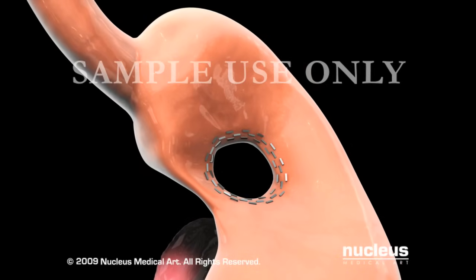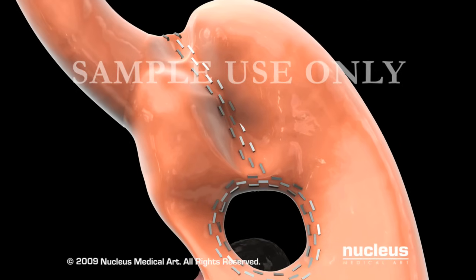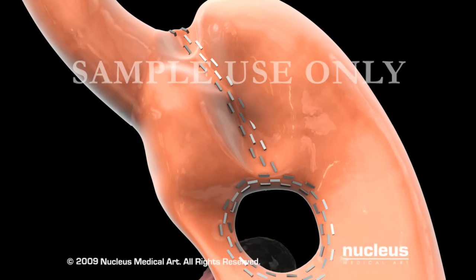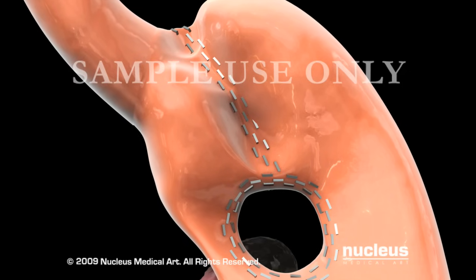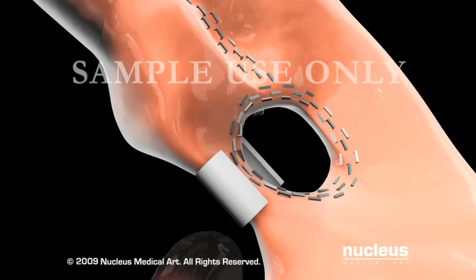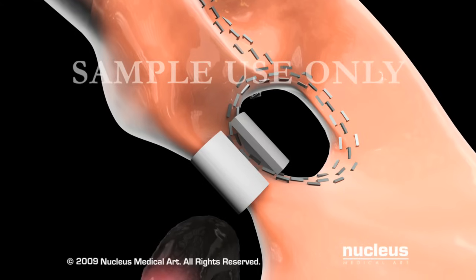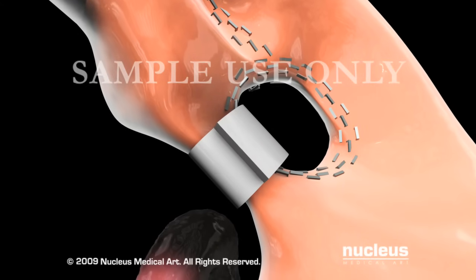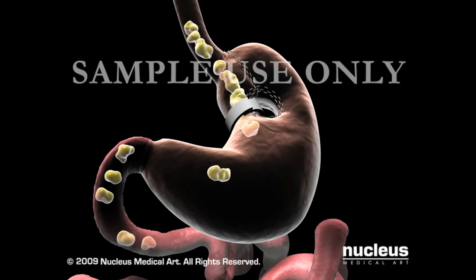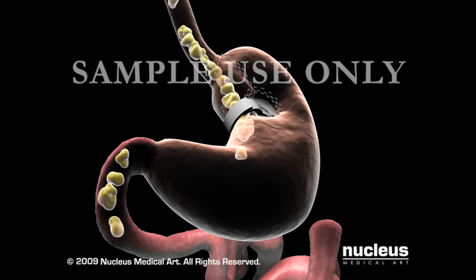your surgeon will cut a window in the upper part of your stomach. He or she will place staples in your stomach around the window and toward the esophagus to create a small pouch on top. Next, your surgeon will pass a rigid plastic band through the window and wrap it around the small outlet of the pouch, which will prevent stretching. Food will move from this pouch through a tiny opening into the lower stomach and the rest of the digestive tract.